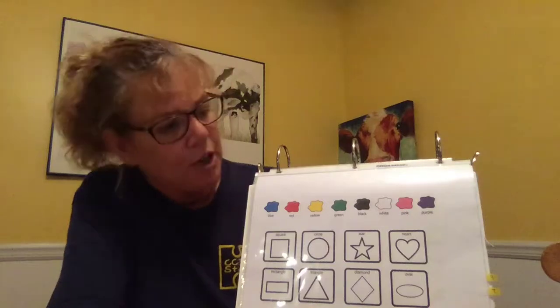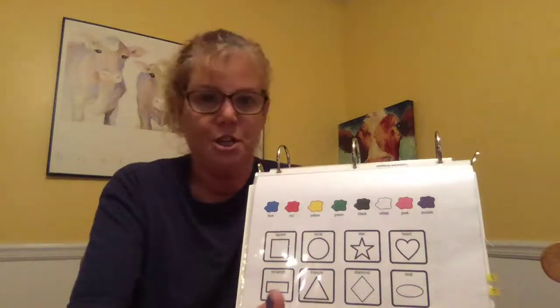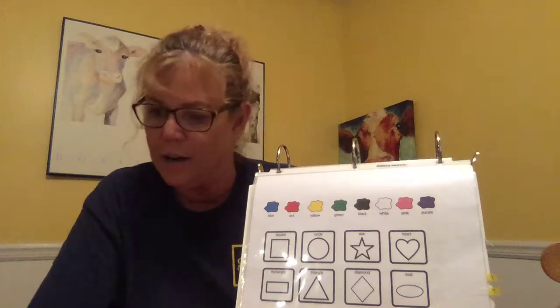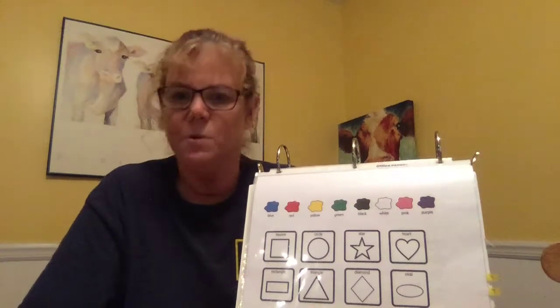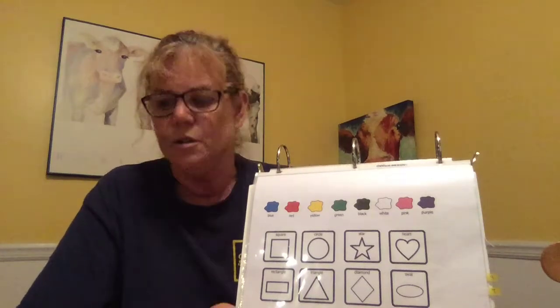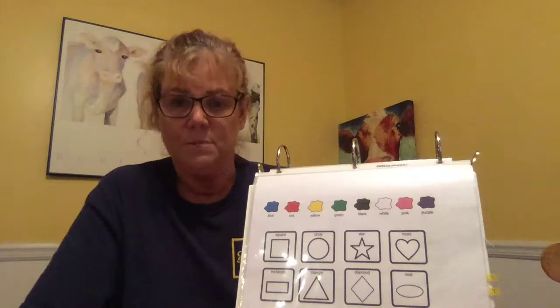So with his communication partner, the teacher may display a pattern, or a pattern may be displayed in front of him if he's working one-on-one. So for example, if the pattern was blue circle, red circle, black circle, blue circle, red circle, what comes next?